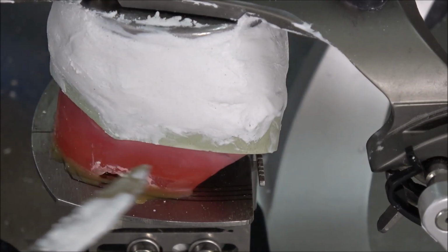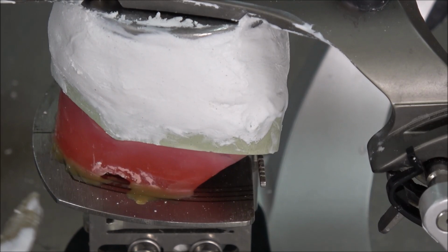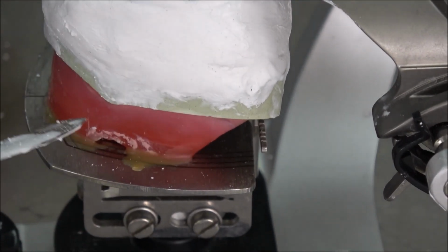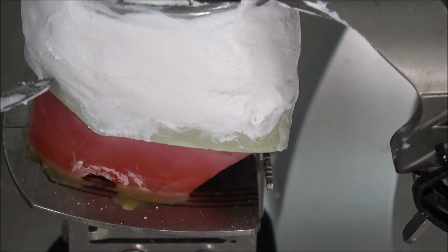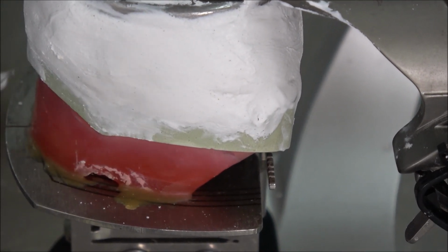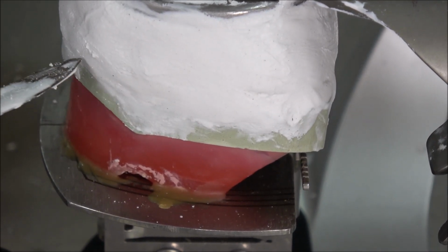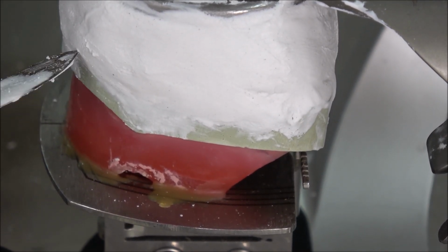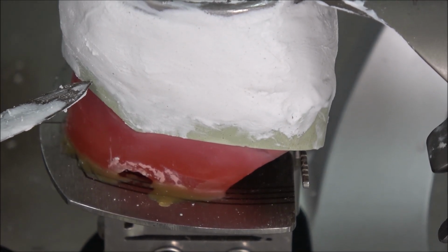After we remove all the excess part, we just leave it, and then for the extension of the POP, we will extend extra to the sides of the model. We will cover like half of the model or 2/3 of the model. Here is the model, we just imagine. We will extend a little bit extra, extra half or 1/3. You can extend until here.